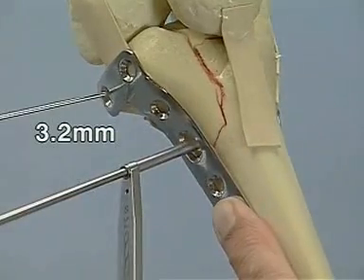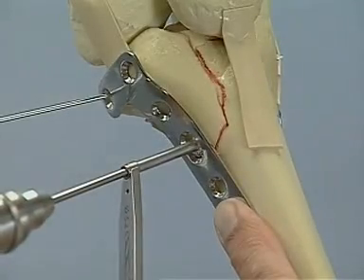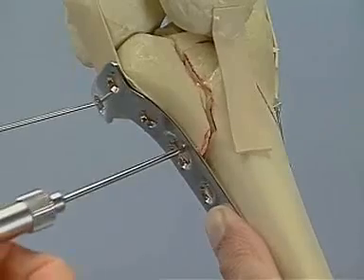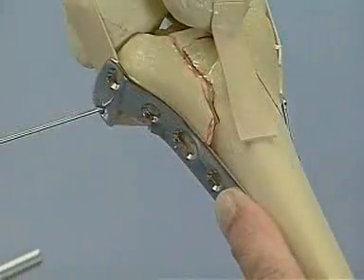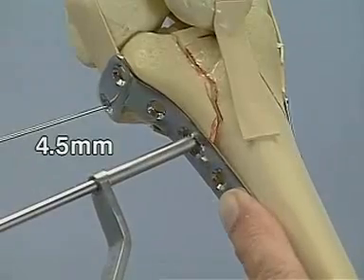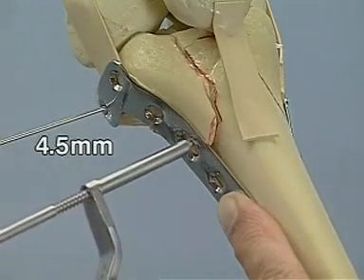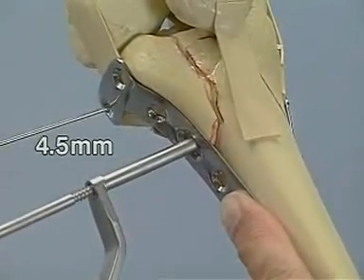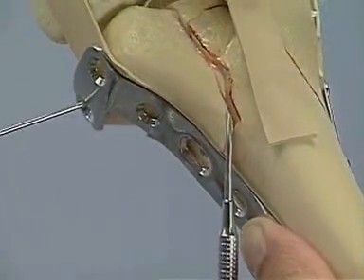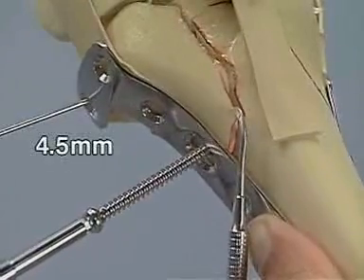We therefore start with the 3.2 mm drill bit. We measure the screw length with the depth gauge. We use the 4.5 mm drill bit for the gliding hole. 4.5 mm tapping.